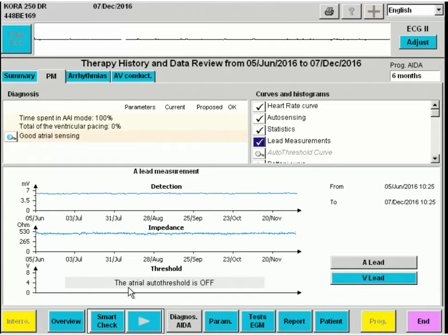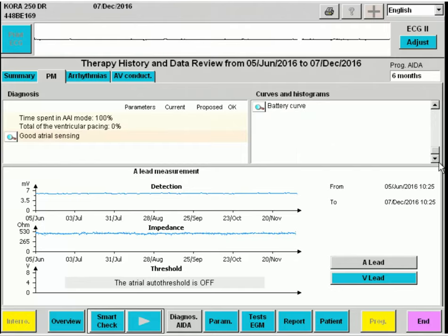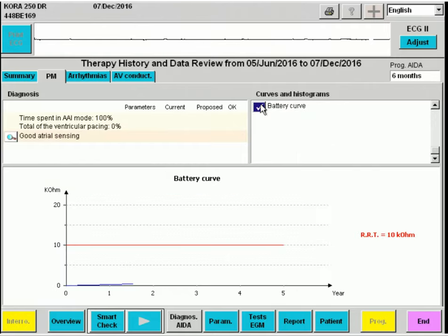Since automatic threshold testing is not programmed, the autothreshold is grayed out and we cannot access it. At the end, we can find the battery curve, which is very important to follow in any pacemaker.